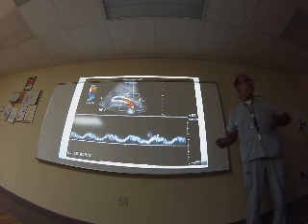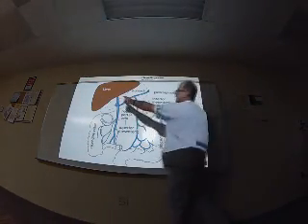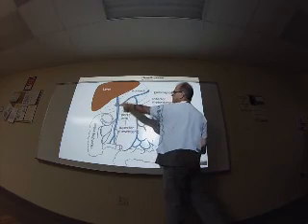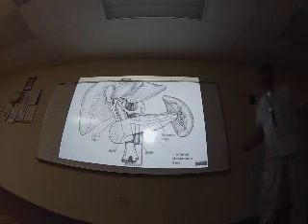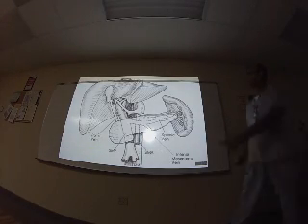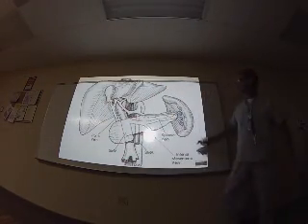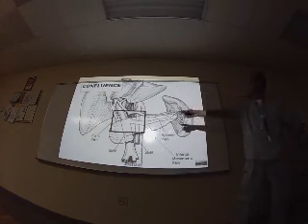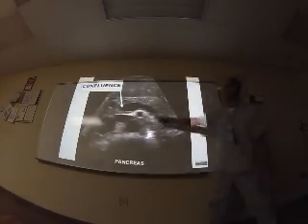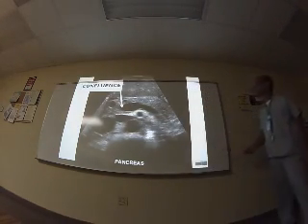Also, in sagittal it's round. In transverse, it's long. You can see different pictures of the same: portal vein, confluence, splenic vein, inferior mesenteric vein, and superior mesenteric vein. Okay, another picture of the same. Looking here, the gallbladder. But this is the portal vein here. You can see here the pancreas. This is the confluence behind the pancreas. The confluence is here. And this is the confluence here.